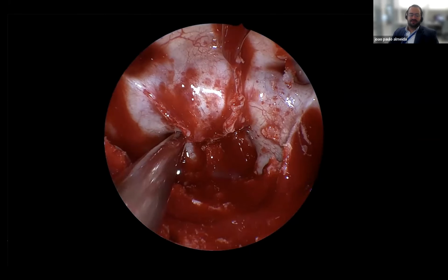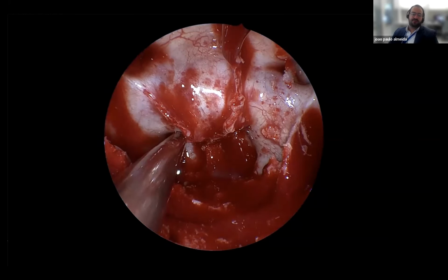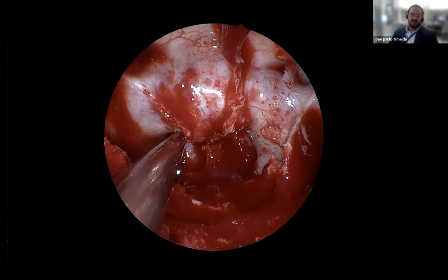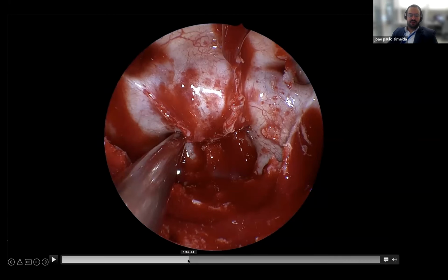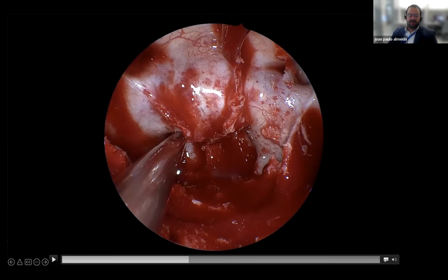And you see here, this is a view of the posterior wall of the sphenoid sinus, right? Which is already kind of like the skull base. And we always identify the same things. And in my opinion, if you can't identify this, probably you're not going to be able to do this as well as you could. So this area here, the center of our approach, and where the gland sits, is the sella. Okay, so all of this area here is the sella.